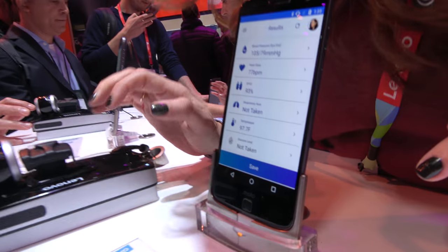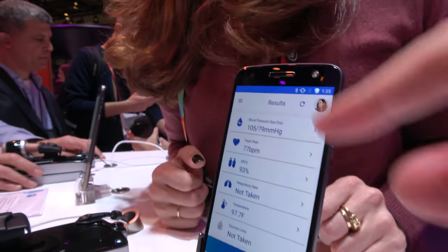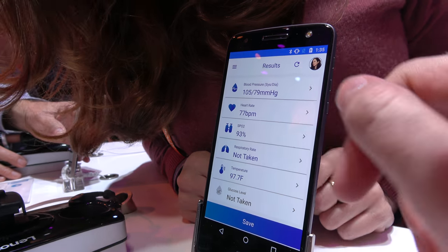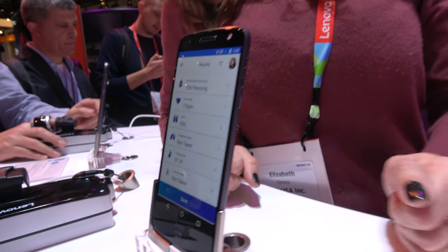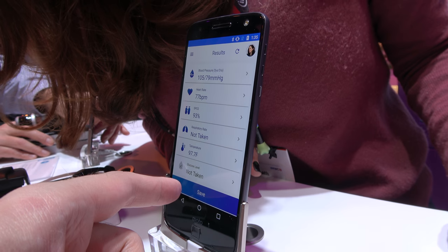So what do we have here? He's perfect. The SpO2 — how much oxygen he has in his blood — is actually a little low. You need to breathe; you were nervous during the video. And then the temperature — I know that's in Fahrenheit.